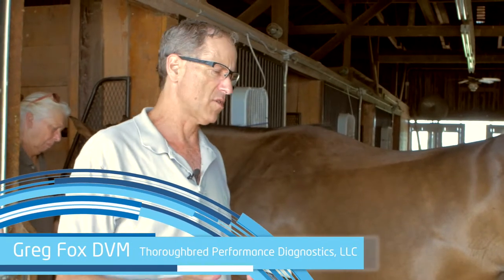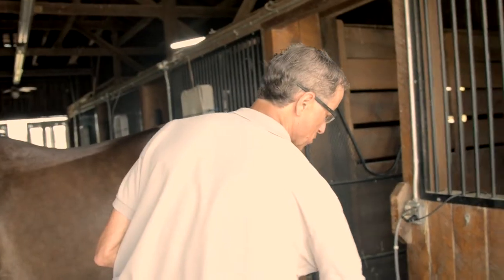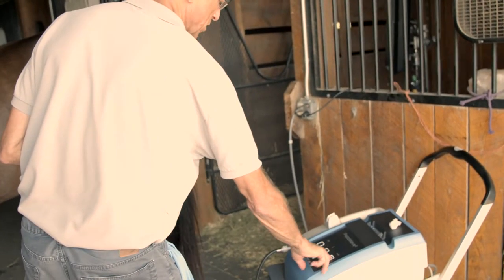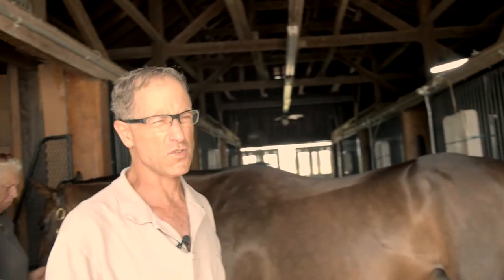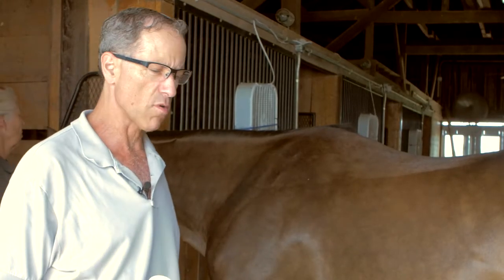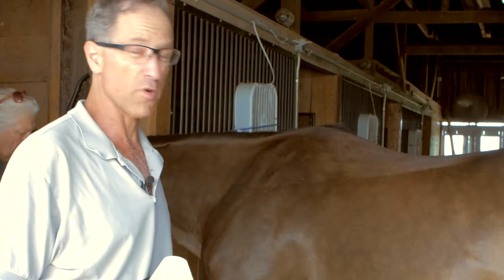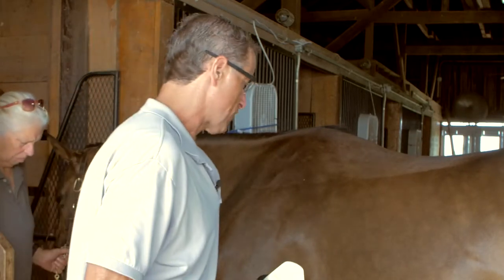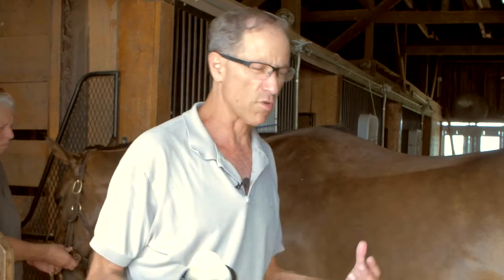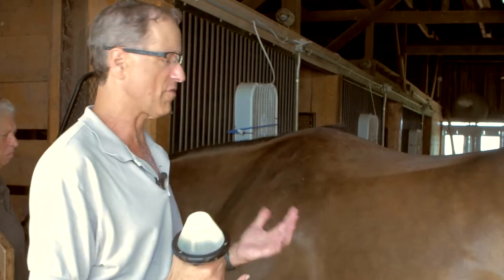I'm going to talk about how I address front high suspensory syndrome, which is an extremely common, frustrating, and challenging area to manage in the racehorse and in event and performance horses. My mantra is: every horse either has had a high suspensory, has a high suspensory, or is going to have a high suspensory — it's really common given what we're asking of these horses.